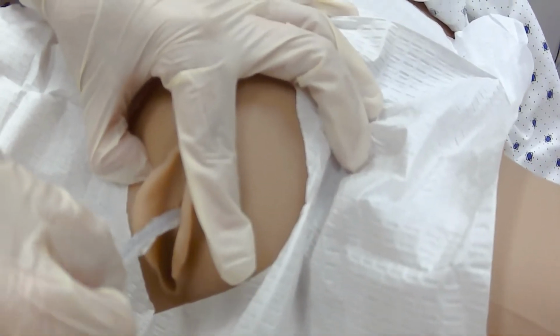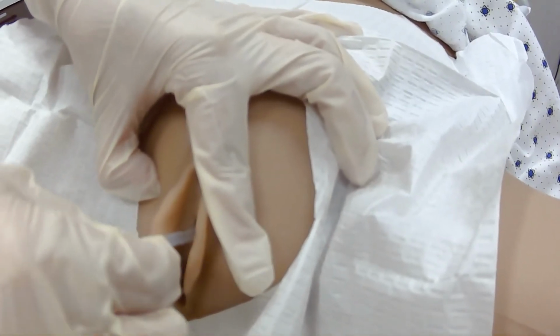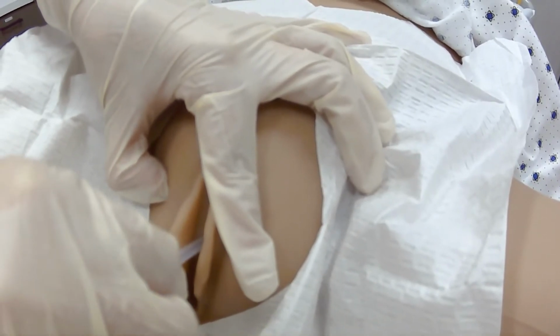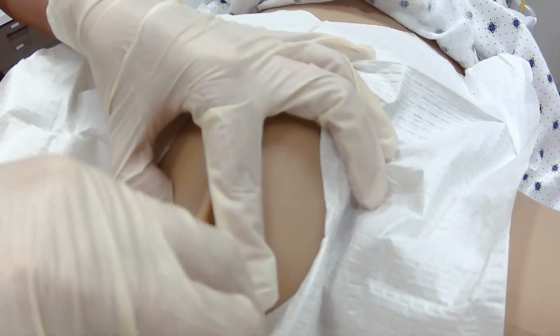Okay, and we're going to insert and make sure that it is in, and you should not feel any resistance. If you do, then you might not be in the right place. Okay, and we're going to insert until we see urine.